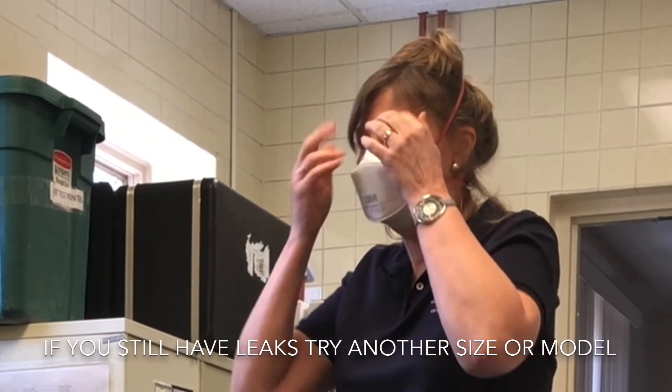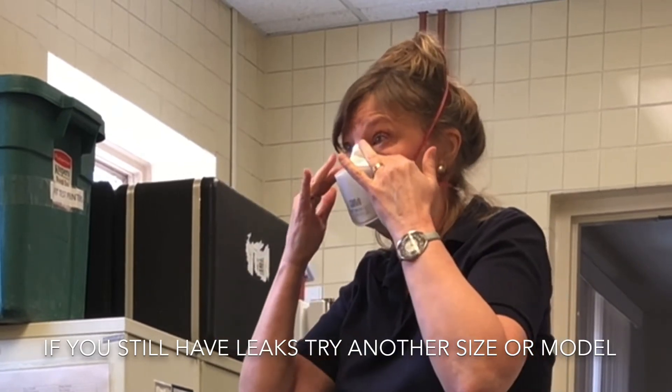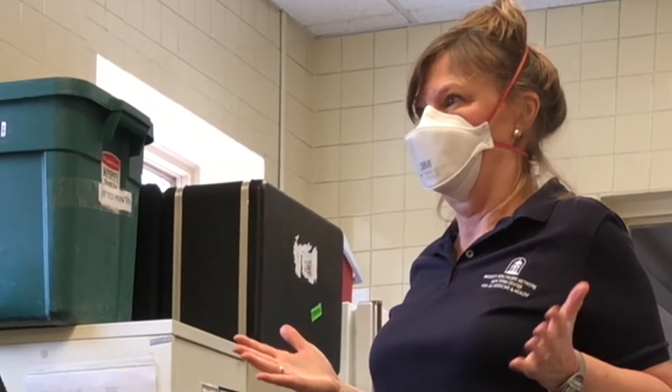If it doesn't have a good seal, then you take it off the same way we took it on. You try to reposition it on your nose. You want to avoid touching your face all the time.